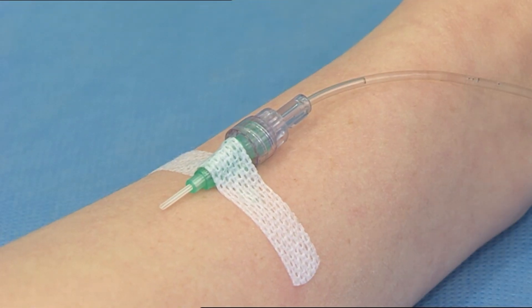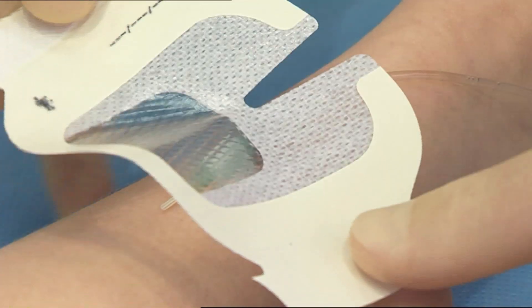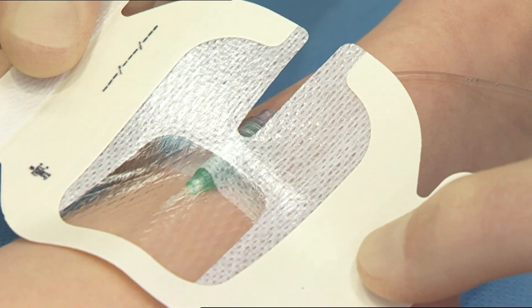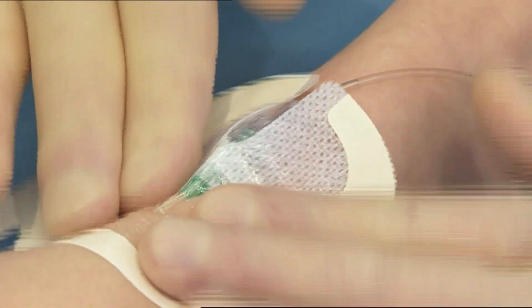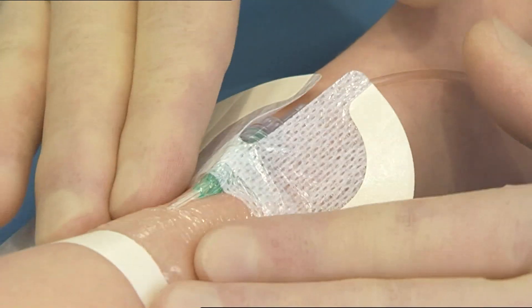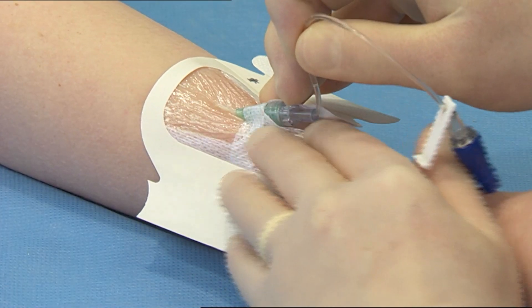Peel the paper liner from the paper framed dressing, exposing the adhesive surface. Using the dressing handles and incorporating a non-touch technique, place the dressing over the catheter so that the transparent film is over the insertion site. Cross over the soft cloth sections under the catheter hub.